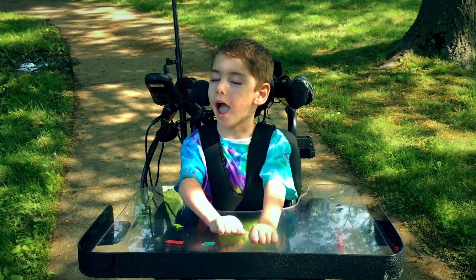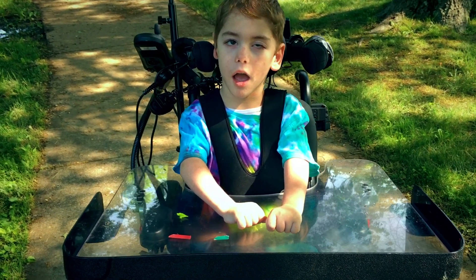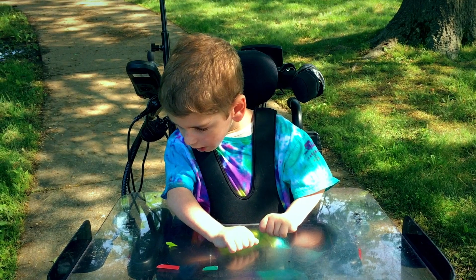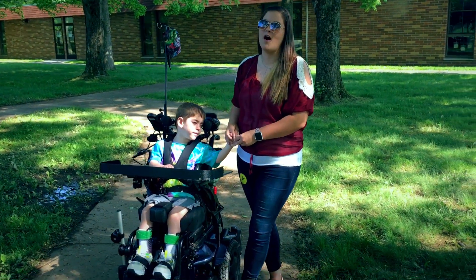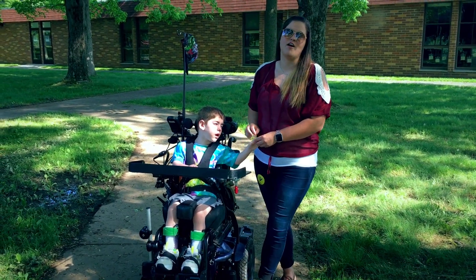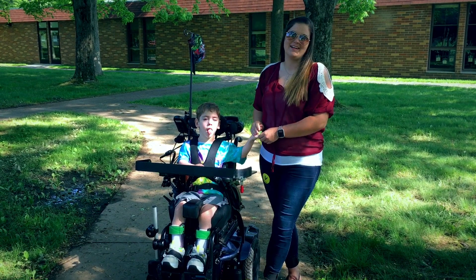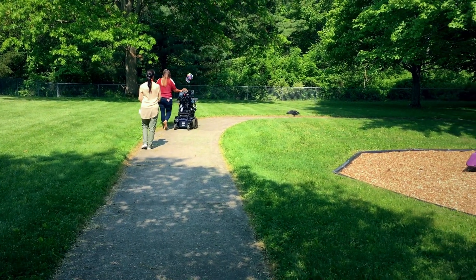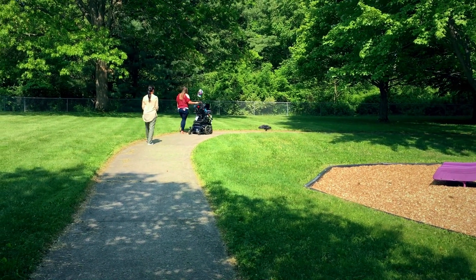Do you love your Zippy power wheelchair, Paxton? Do you love to go fast in your power wheelchair? Yes! The power chair is kind of like experiencing your child walking or talking or crawling for the first time. It's definitely an experience that's overwhelming, exciting, and something new. Seeing your child have some independence for the first time in five, six years is amazing. We've waited a very long time for that.